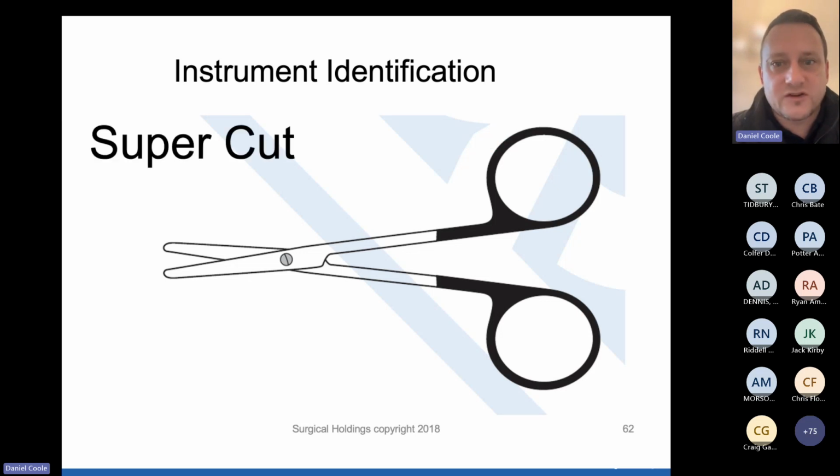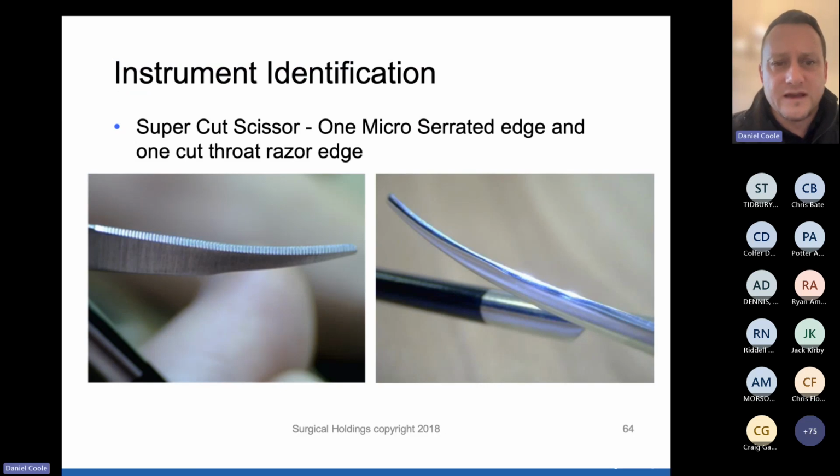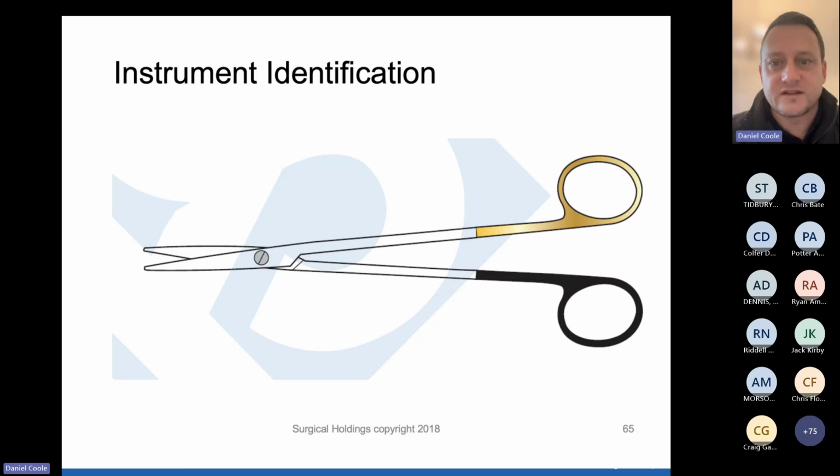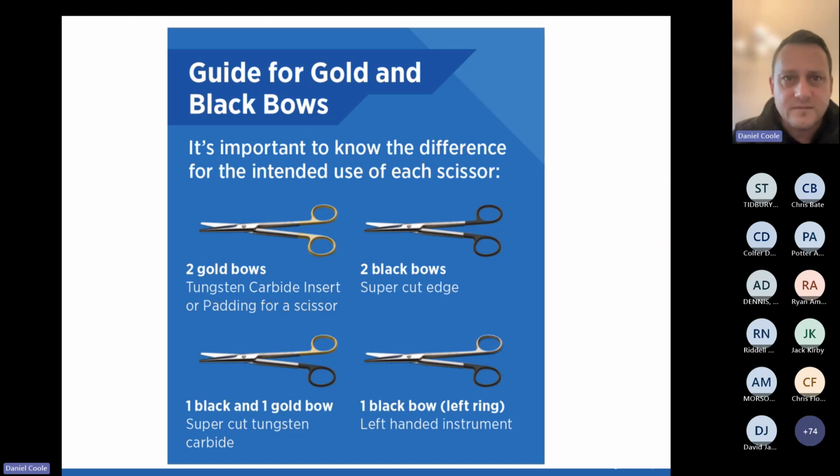2 black bows is supercut, and that in this case is a strabismus scissor. Some different examples of supercut scissors here, and that's what supercut looks like. So it's one micro serrated edge which provides your grip, and the other edge which is a really ultra sharp edge that you might get in a barber's sort of razor, that sort of sharpness. So combine the two and we get supercut with tungsten carbide, which provides us with a very robust scissor. So as a quick guide here, we have one we didn't mention at the bottom that we see sometimes, one black bow to denote a left-handed instrument, a left-handed scissor in this case.